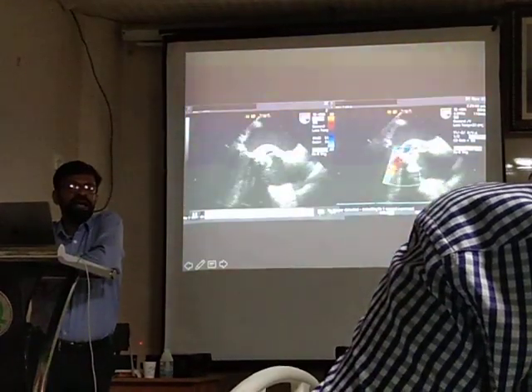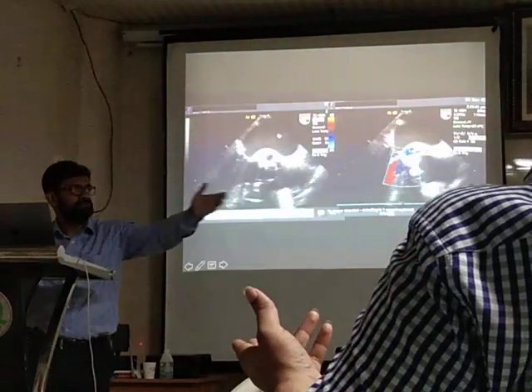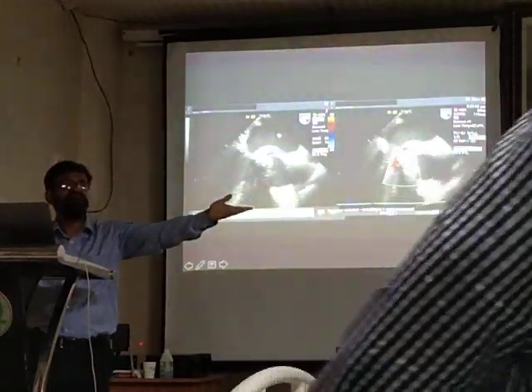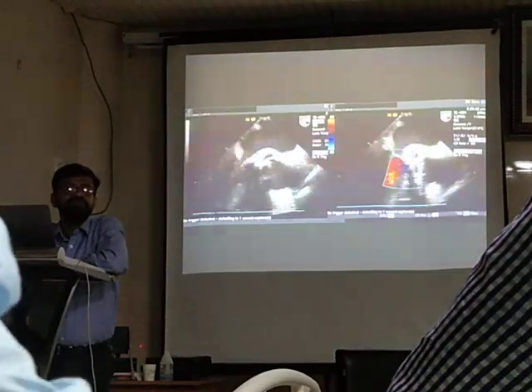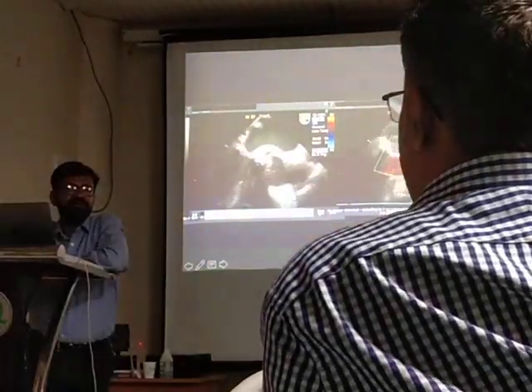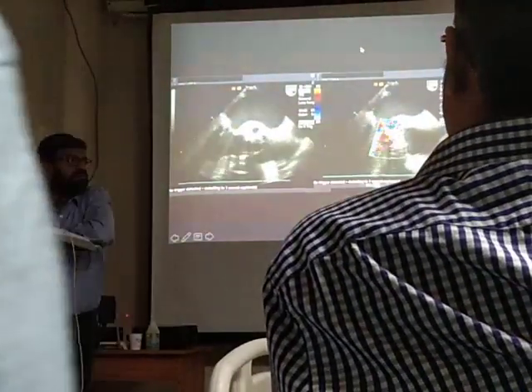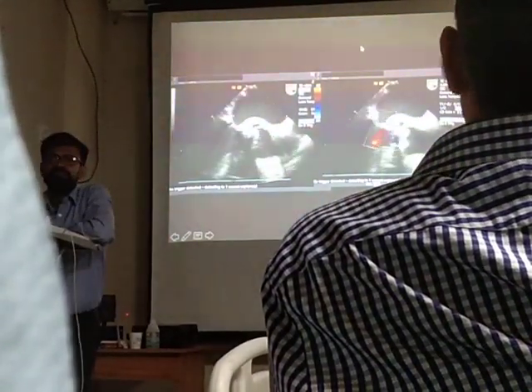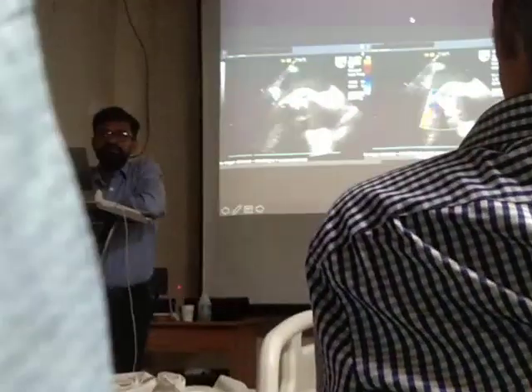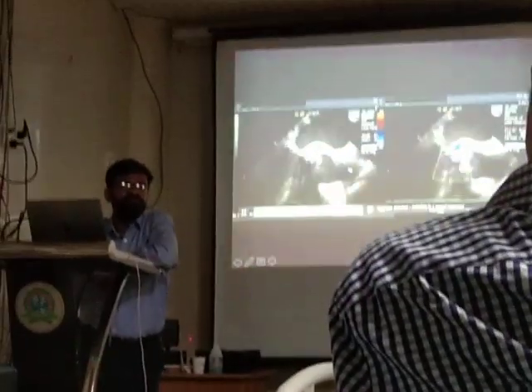So, but tissue black is here. Fluid. It is abscess. This is a case of mitral prosthetic abscess with severe regurgitation. It is an emergency. Tell the patient that he is going to die. Big concern. Plus dehiscence. It's paravalvular.